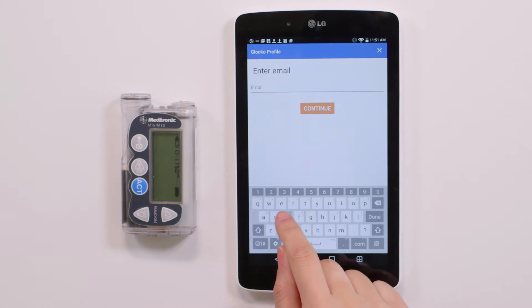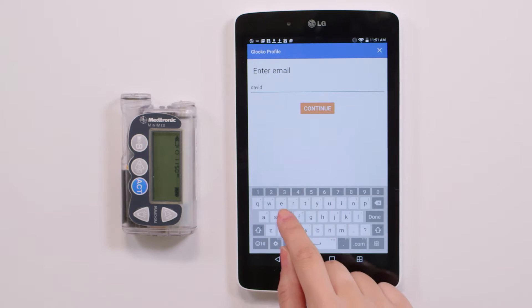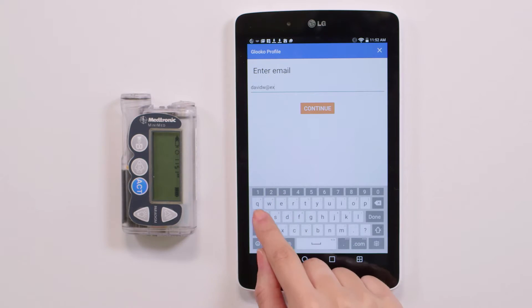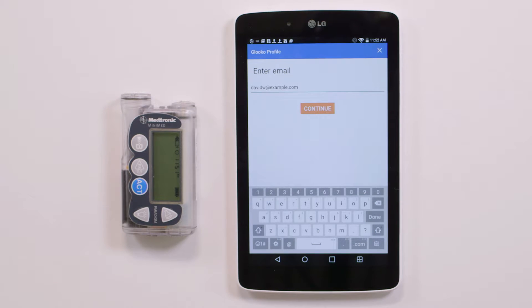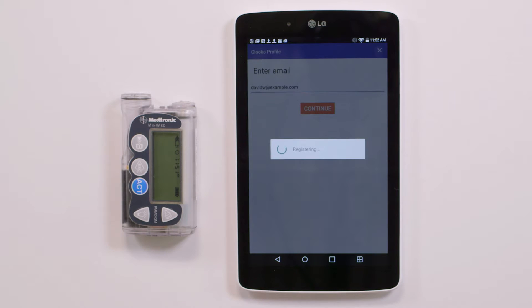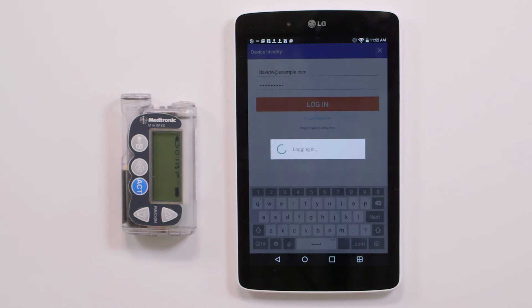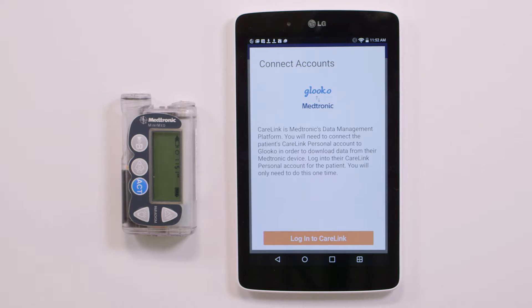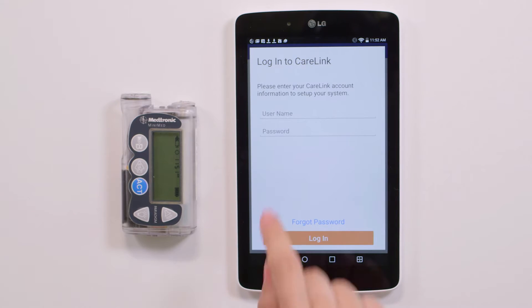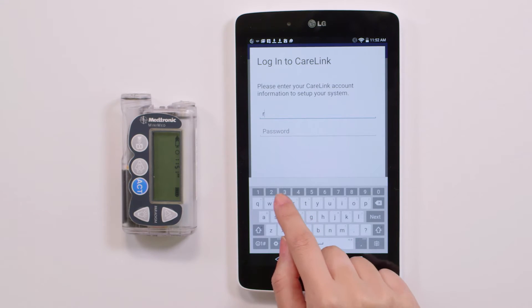The email address field is important because it allows your patient to have access to their synced diabetes data at home via Glooko. If your patient does not have an email address, no worries, just tap Continue. To allow Glooko to receive data from the patient's Medtronic device, Medtronic will require you to log in to their existing CareLink account. Enter the patient's username and password.